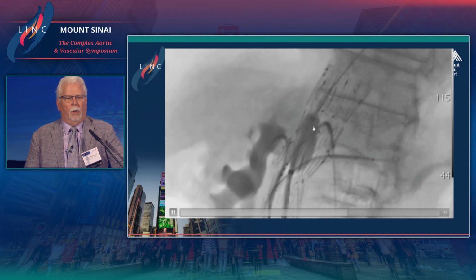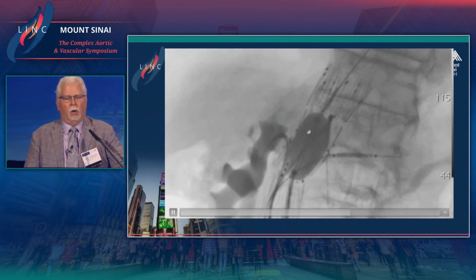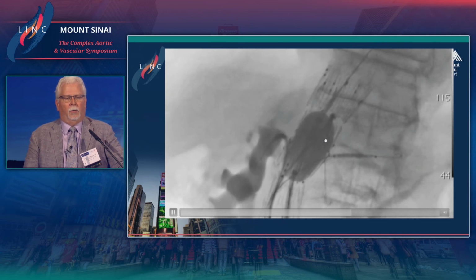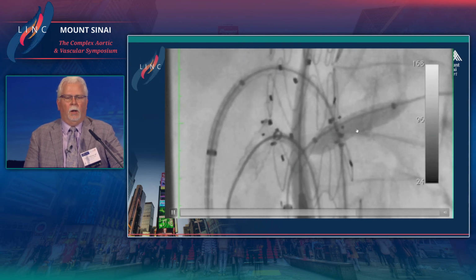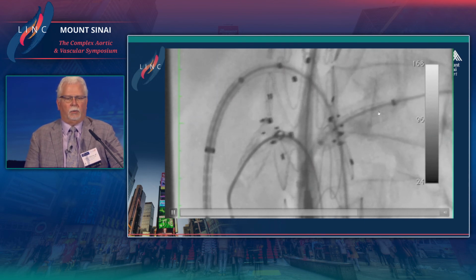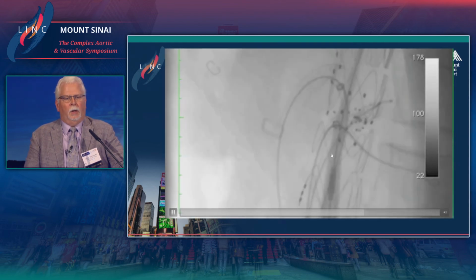Now we're coming in, before we deploy our stents, using a Coda balloon to kind of iron out the fabric of the graft around the aorta. And then we'll come in and we'll do selective stenting as we go through. Here's the fenestrated left renal fenestration. We'll flare that, come out and do the same thing. There's an angiogram showing good flow with good seal here at the left.